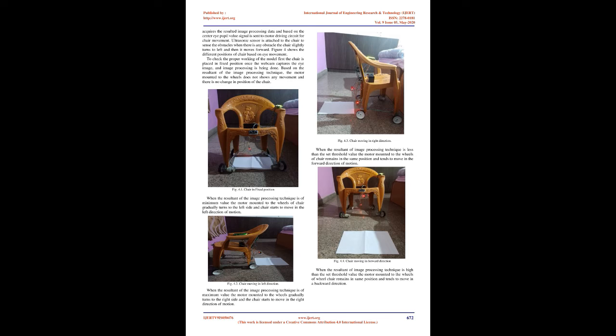Relationship between projection point and eye center is shown by projection function graph. The direction of movement of eye is indicated by x and y scale points. The eye pupil position at A0, B0 points is A0 equals A1 plus A2 and B0 equals B1 plus B2. A1, A2 equals eye pupil corner point in x direction. B1, B2 equals eye pupil corner point in y direction. Coordinate points A0, B0 equals actual eye location.